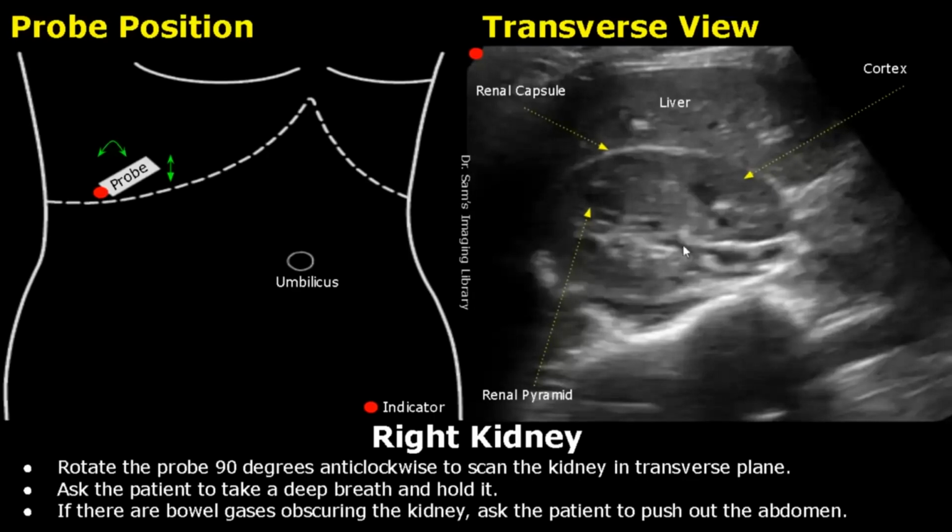If there are bowel gases obscuring the kidney, ask the patient to push out the abdomen. This moves the bowel gases away from the kidney.